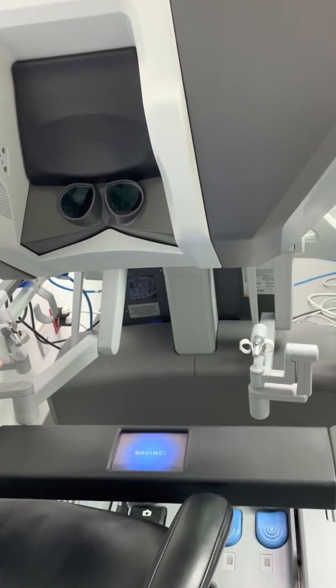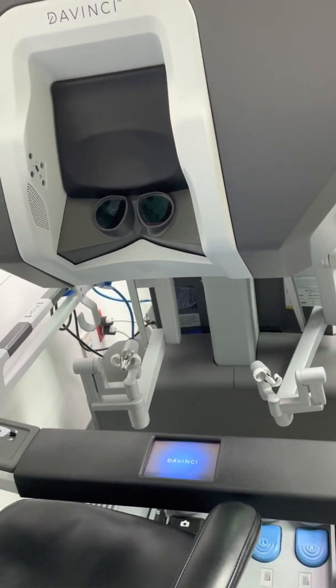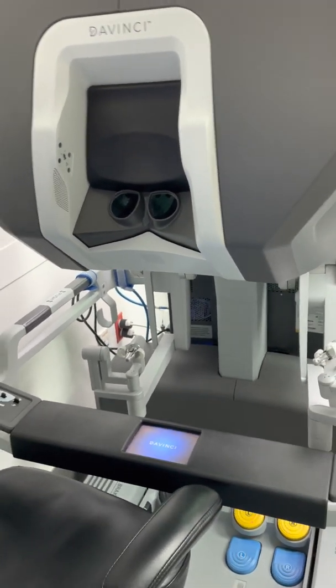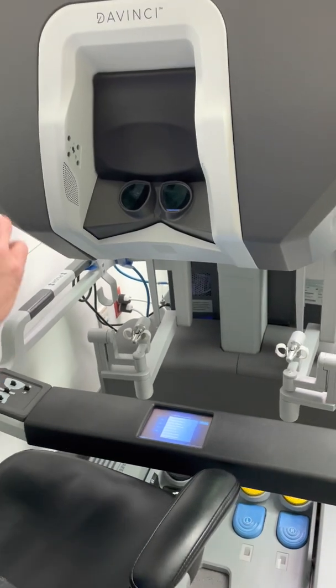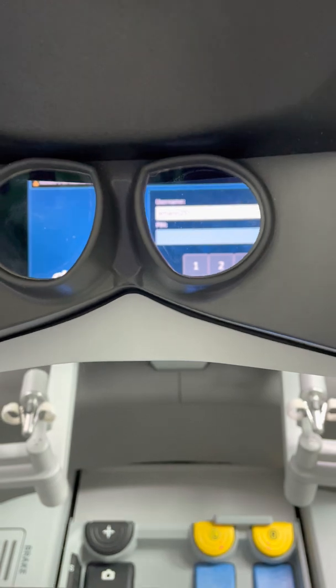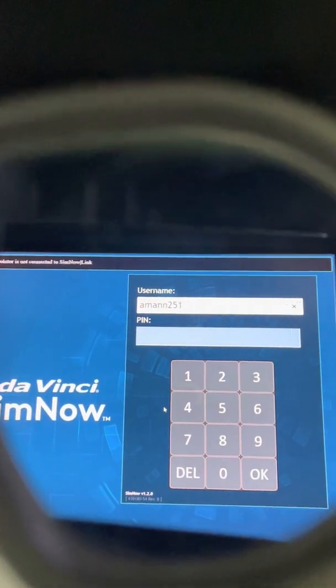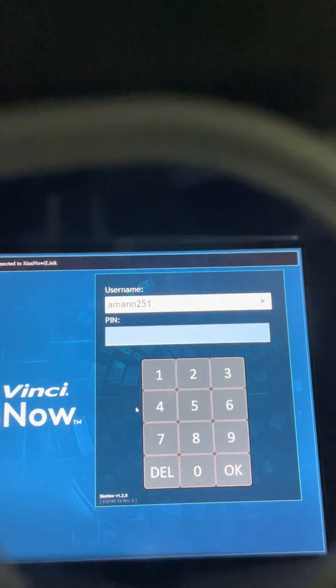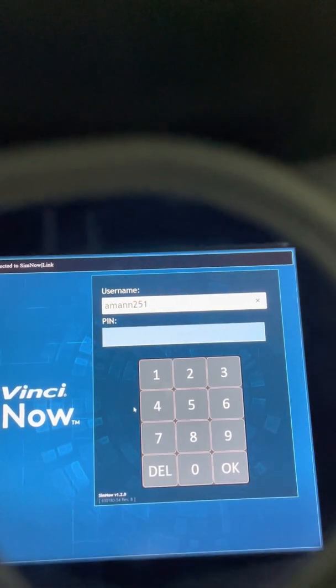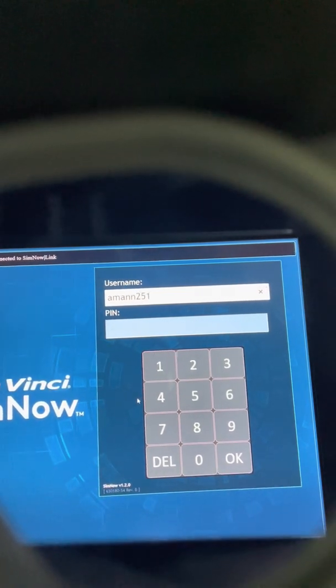The arms are going through a system check — you've got to give it a few seconds. If you stick your face in, it'll say no signal. As soon as the main menu pops up, that's when you can stick your head in. The top right will be your username, and right below that will be the four-digit PIN code that you use to set up your simulator. And then you're good to go.